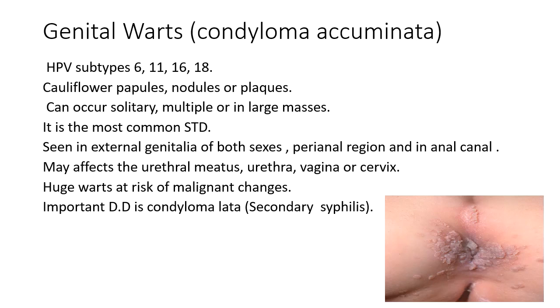Histologic features of condyloma acuminata. Overall, it's a verrucous or warty architecture. There is acanthosis with papillomatosis, hyperkeratosis, and hypergranulosis of the squamous epithelium. Broad papillae with rounded ends which are fused at the base. Viral cytopathic effects can be seen like variable koilocytosis and binucleate cells. Usually there is no stromal inflammation.